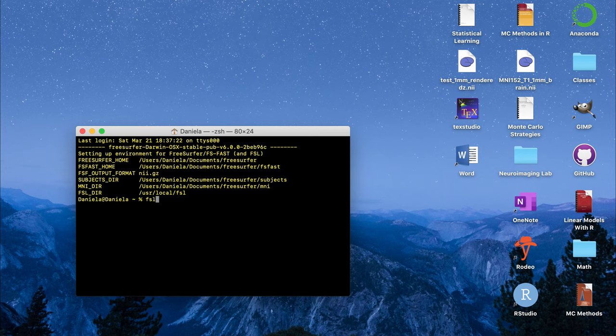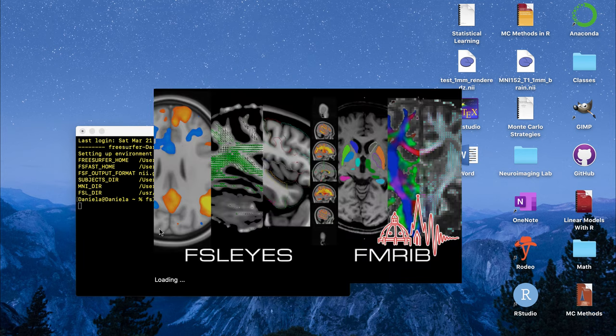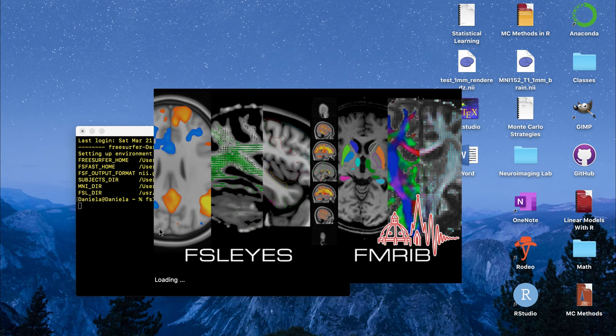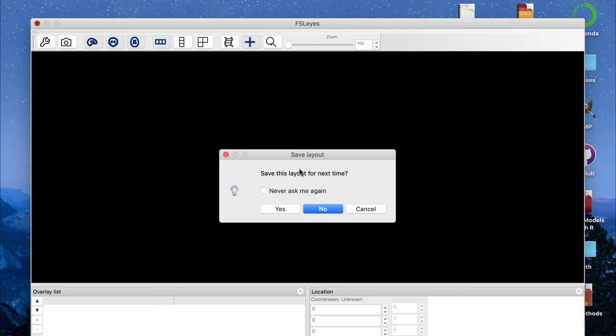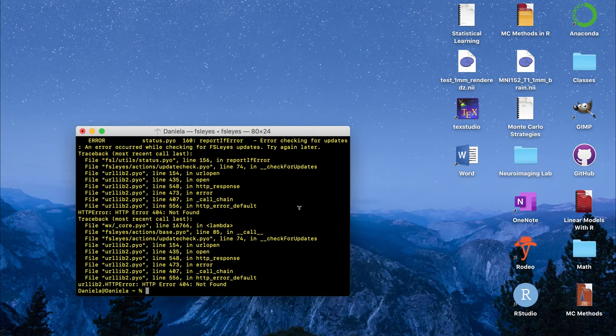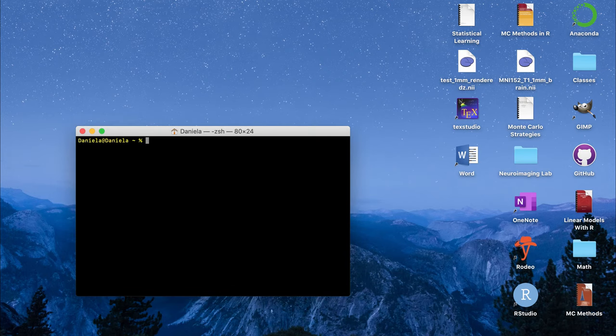If I open FSLeyes, that's a command to open the MRI or fMRI viewer in the program FSL. If I run that command and I already have FSL installed on my computer, it should open up the viewer and we're going to use some commands from FSL to create these brain masks.